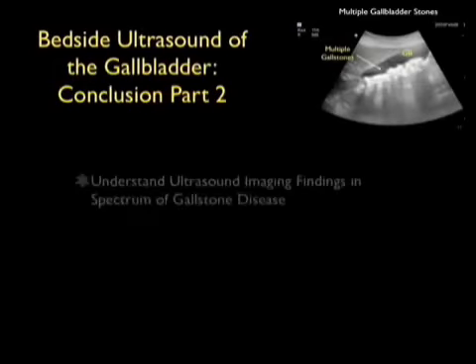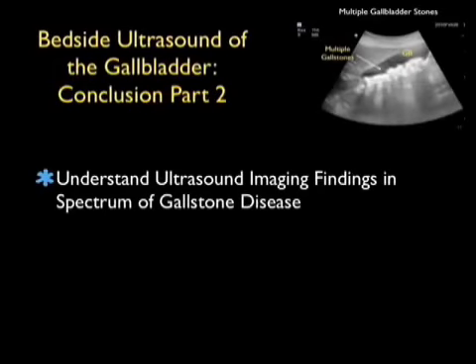My conclusion points for this Soundbites module going over part 2 of bedside ultrasound of the gallbladder.